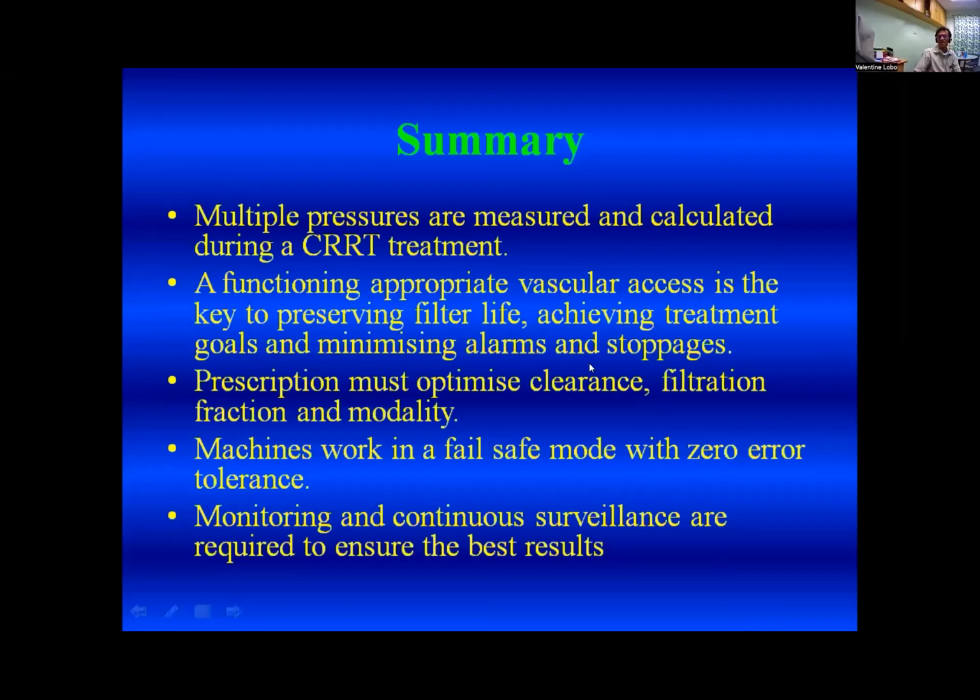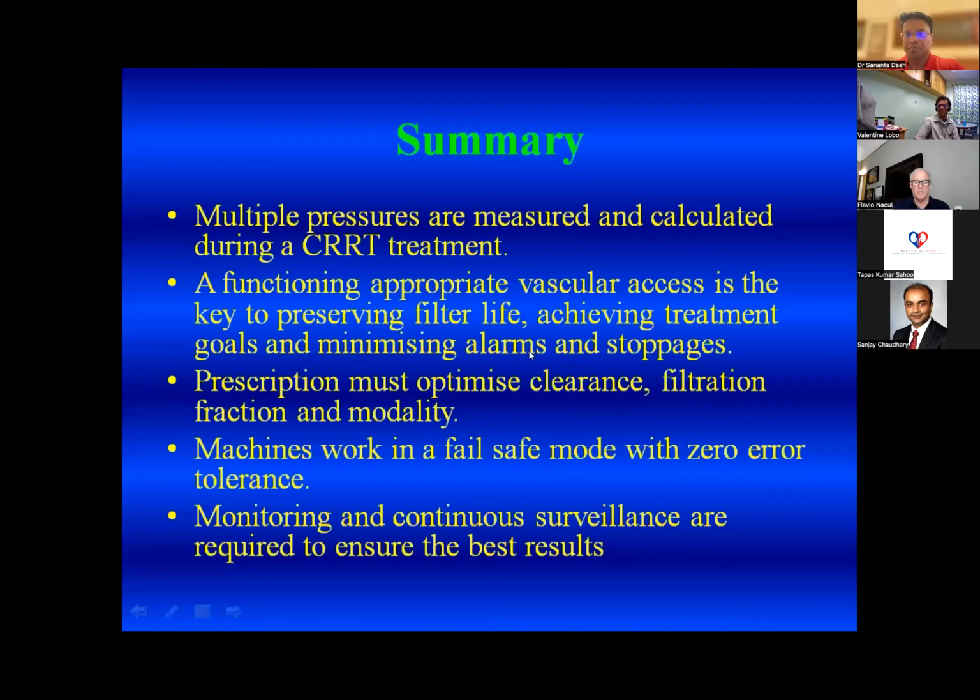It's said that the risk of a patient facing a complication due to machine malfunction is around 1 in 100 million, which is less than the risk of dying in an accident while crossing the road. But in spite of that, monitoring and continuous surveillance are required. The human factor is required to ensure the best results.